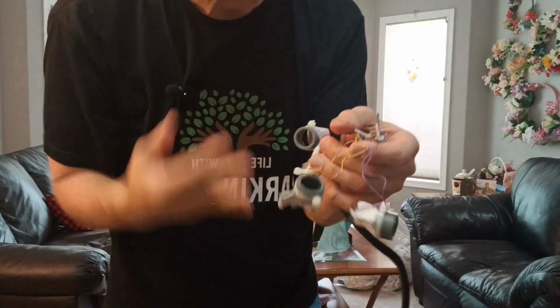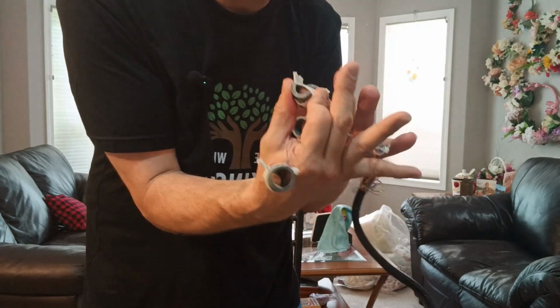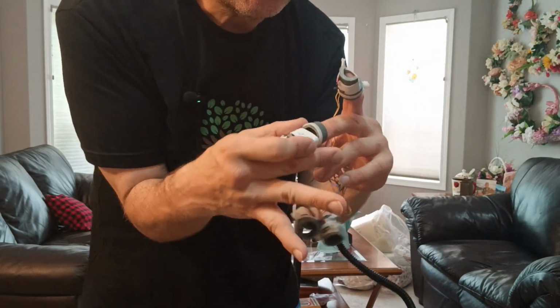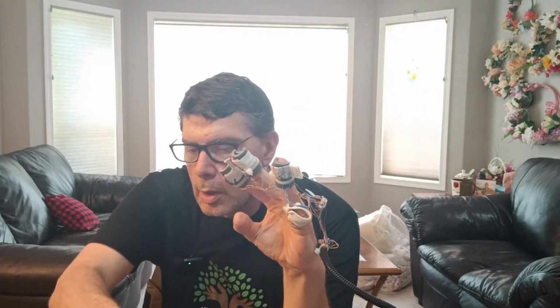My friend Trevor came up with a new system, and I'll just show it to you here. Basically, instead of gloves, you just have little cufflinks, and they're numbered so we know which motor is which. And they just individually slide onto your fingers like this. There we go. And it provides much better protection for the wires, because if you look at a motor, where the motors were breaking was right at that little black tip. The wires would come off, or the other end where the small wires come out. Those are the two weak points that we've been trying to overcome.